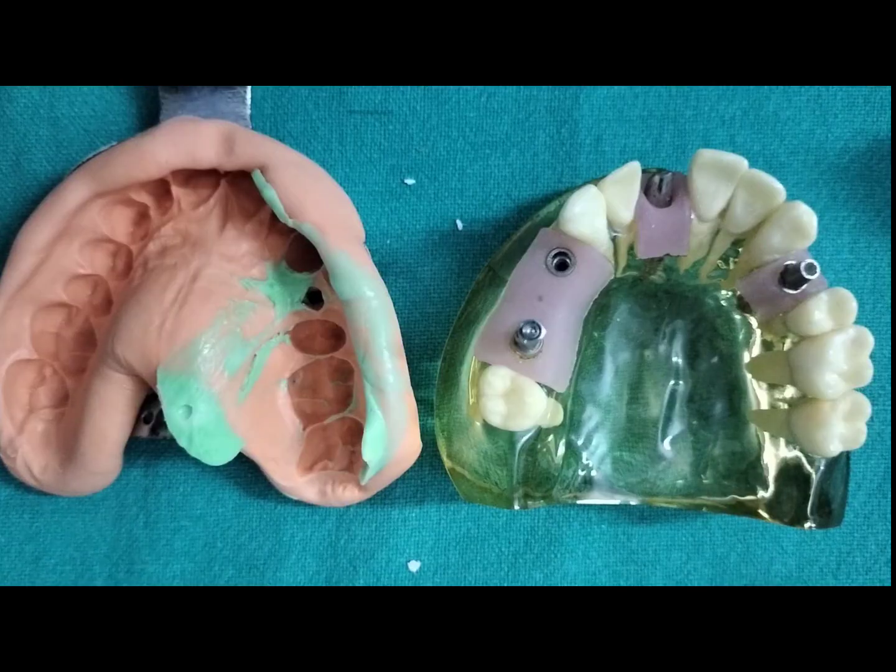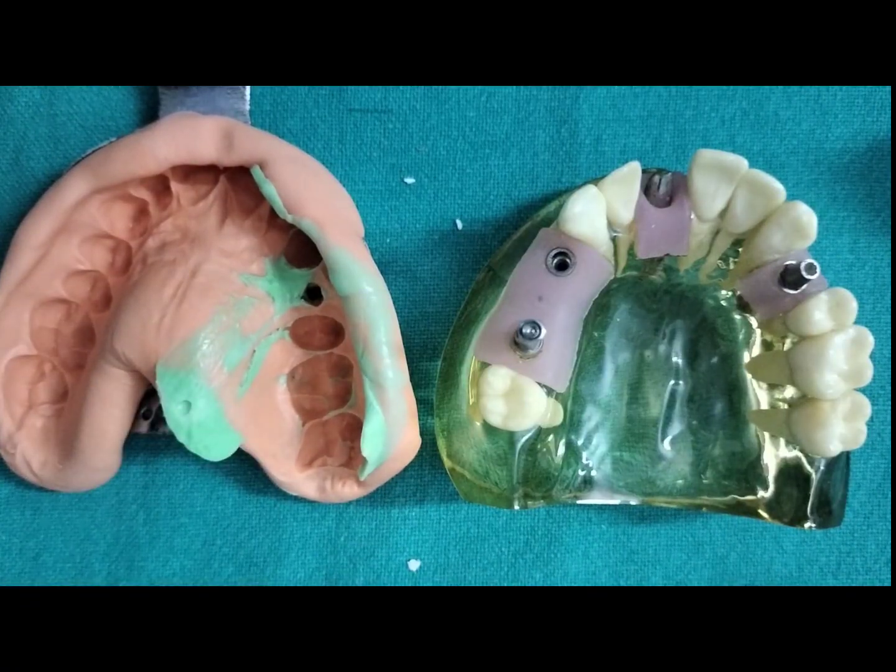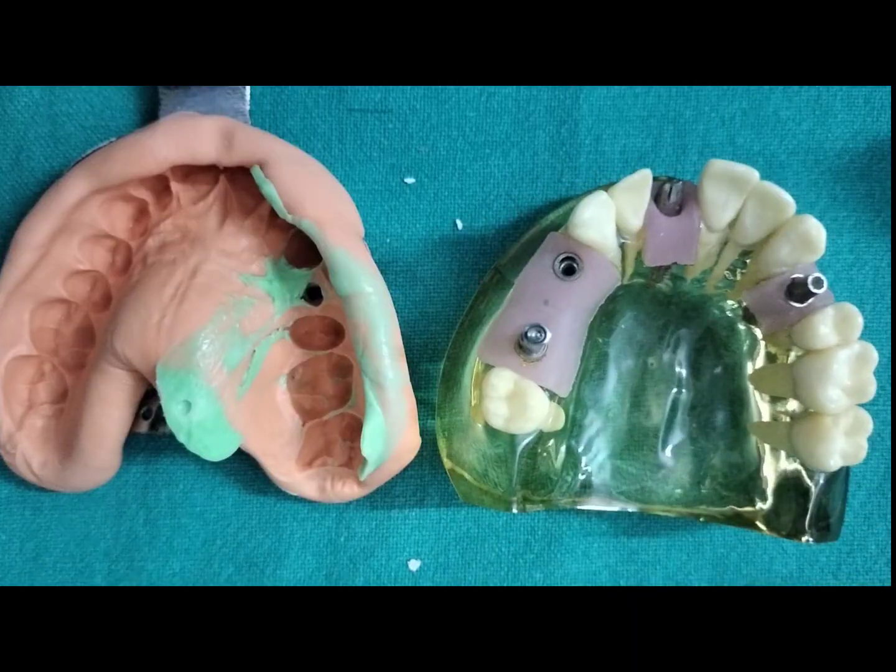So quickly to revise, remember a very simple rule: for single implant you use a closed tray technique, and for multiple implants you use an open tray technique. So understand this principle rather than memorizing these steps.